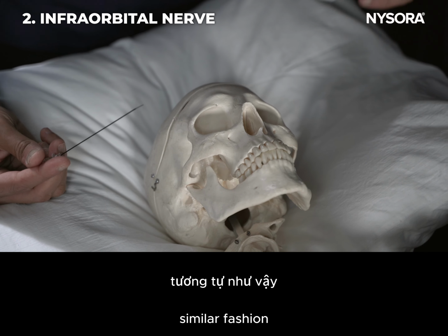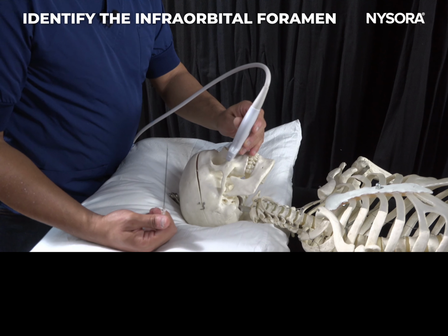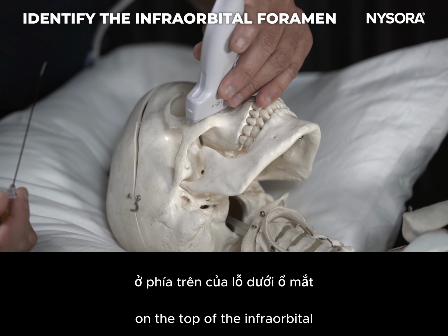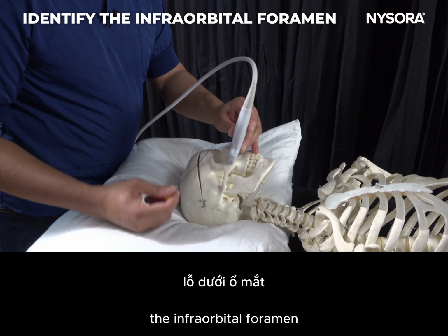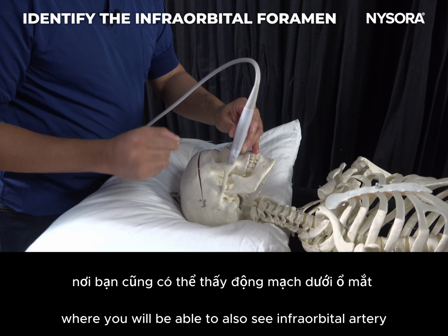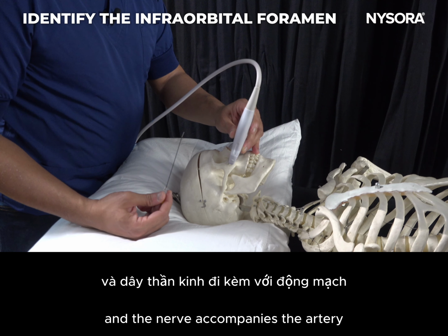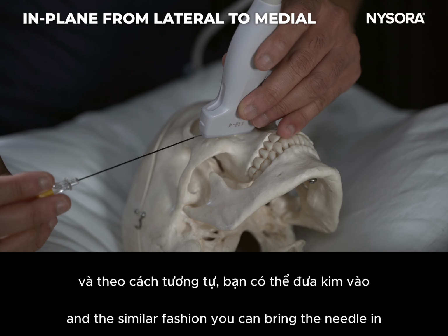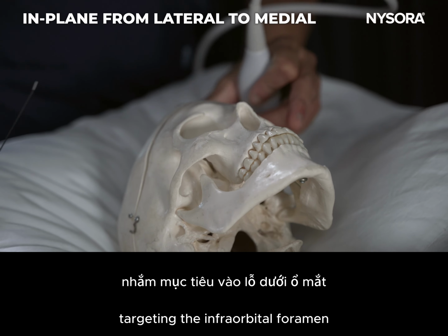and steroid. In a similar fashion, you could start to scan for the infraorbital foramen, where you would put the ultrasound probe on the top of the infraorbital area, where you will be able to find the infraorbital foramen, where you will be able to also see the infraorbital artery, and the nerve accompanies the artery. And in a similar fashion, you can bring the needle in plane using the ultrasound guidance, targeting the infraorbital foramen.